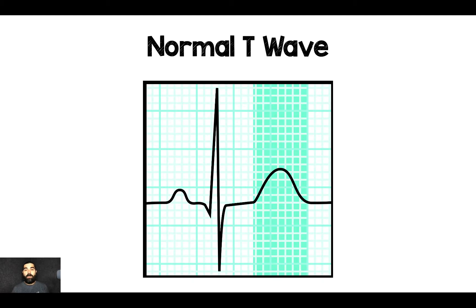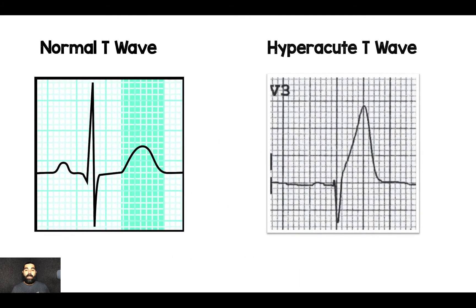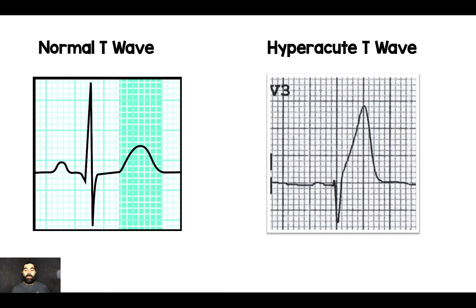Now let's look at a normal T wave — this is all about proportionality. You can see the T wave is relatively small and very symmetric compared to the QRS; this is what normal T wave morphology looks like. If I zoom in on V3 from that previous EKG, you can see how much bigger that T wave is — broad-based and hyperacute, very tall. It's usually bigger than the QRS, and the way I make this distinction is: if you can fit the QRS inside the T wave, that's concerning for hyperacute T waves.